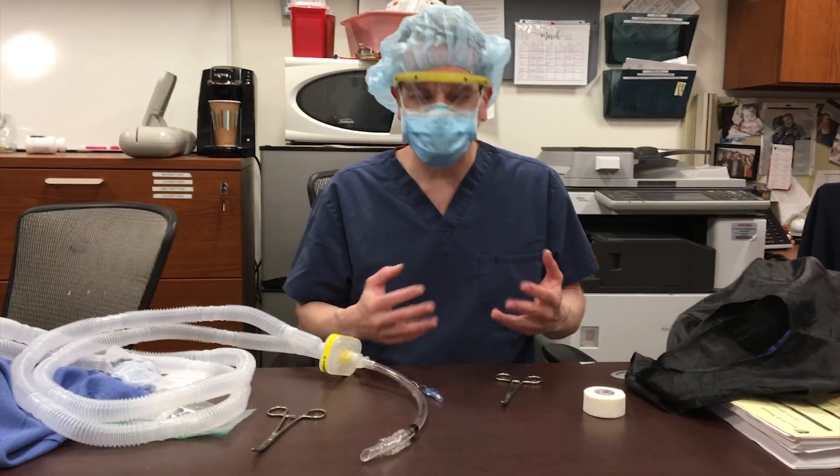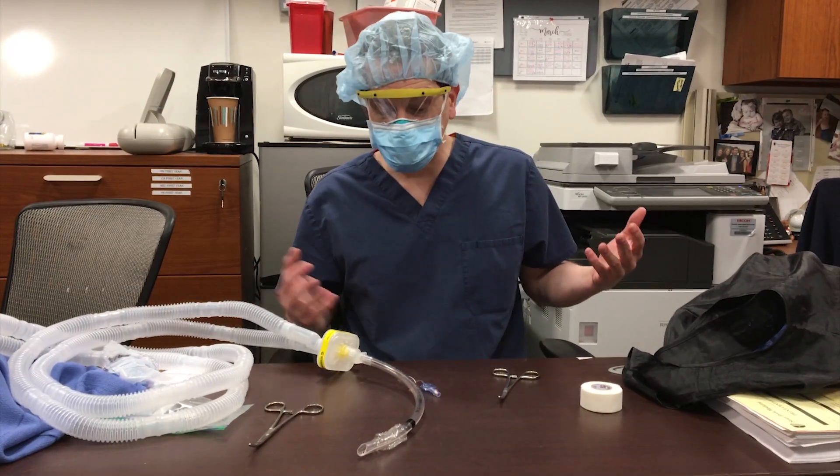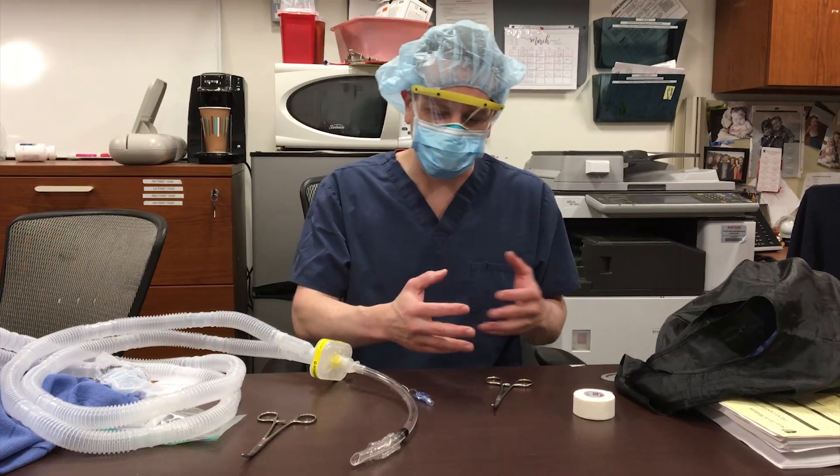The first C is confer. You're going to talk to your partner — because it's best done with a partner — about the entire procedure: who's going to do what, et cetera.